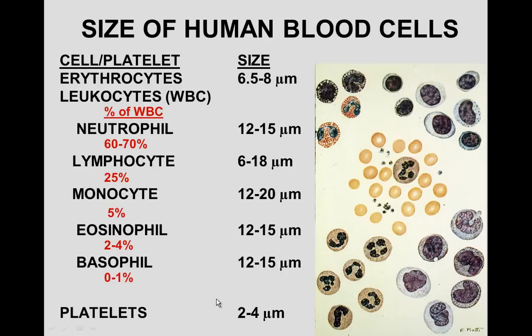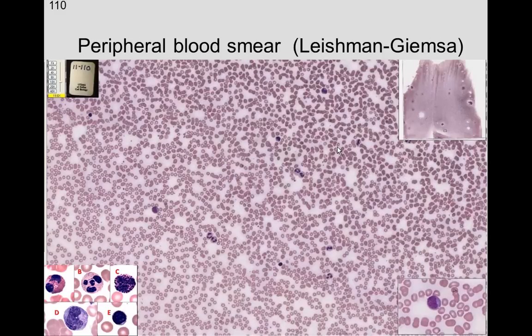The smallest formed elements are the platelets, and here we can see platelets. So we see lymphocytes, neutrophils, monocytes, eosinophils, basophils, and the different components in the blood.